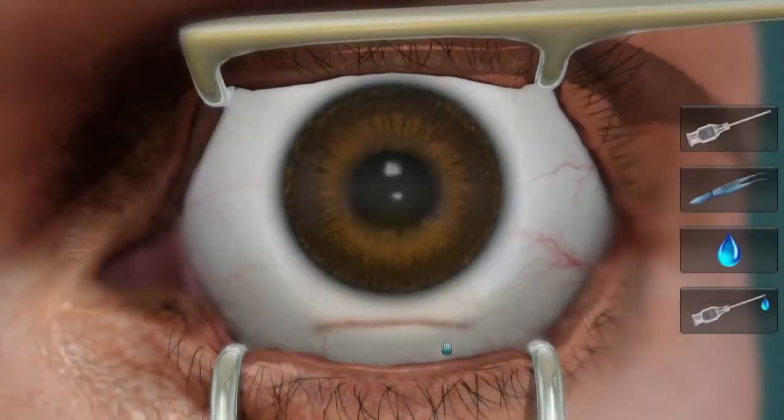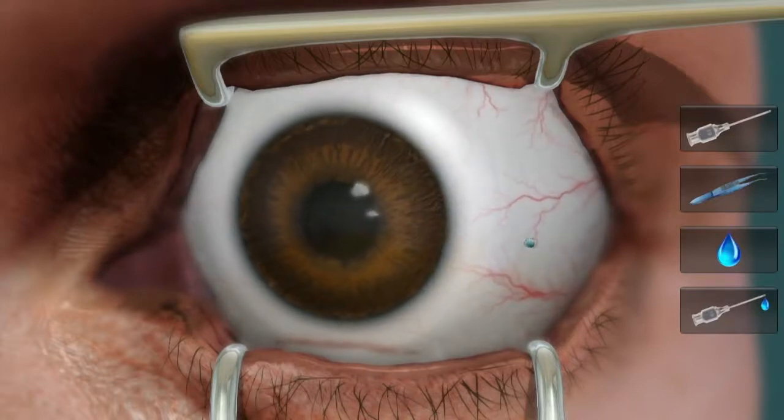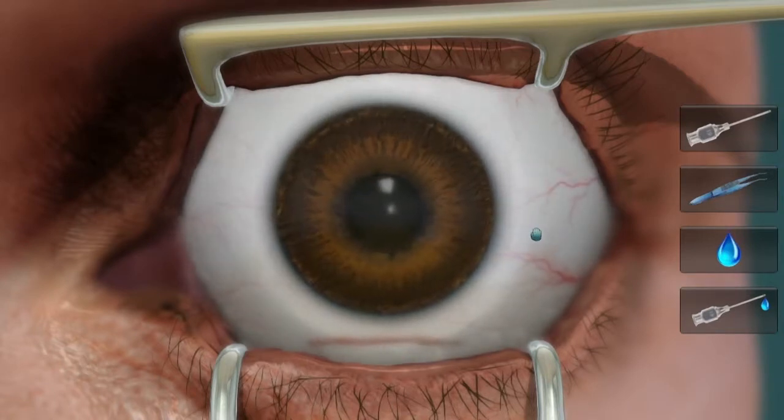The simulation always takes place under the view of a microscope, but if we view the scene as a whole, as shown here, we can see the full setup of the patient resting on the surgical bed, with the eye held firmly open by the lid speculum. Now we can go to the view the surgeon will take while operating, which is under the microscope, as seen here.